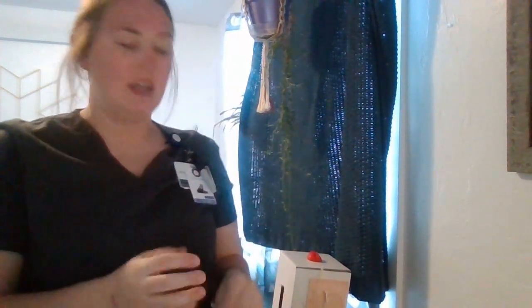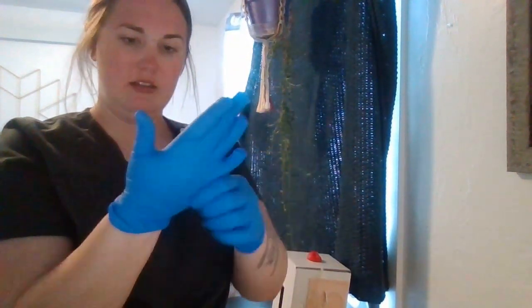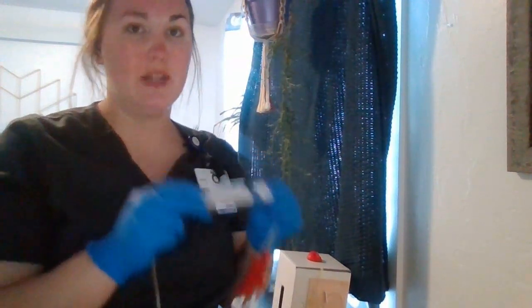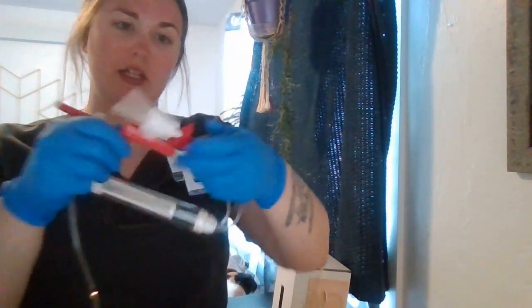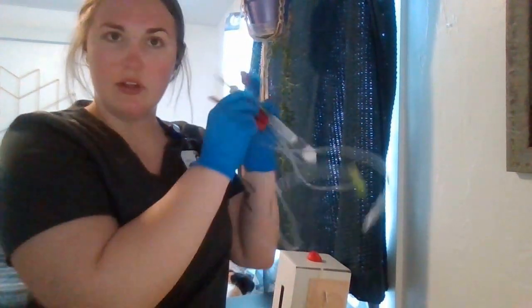I'm going to start by performing hand hygiene — I would wash my hands with soap and water — and then I'm going to put on some clean gloves. Now that I've got clean gloves, I'm going to make sure that I have tubing and I want the tubing to have a filter on it. If it doesn't have a filter, I'm going to get a filter. I'm going to make sure all the clamps on my tubing are closed — so I've got my third clamp here, make sure that's closed, tubing is closed.